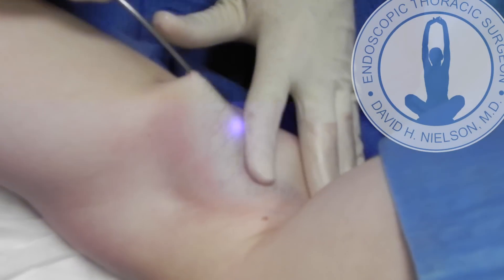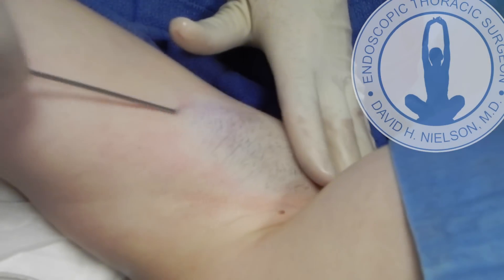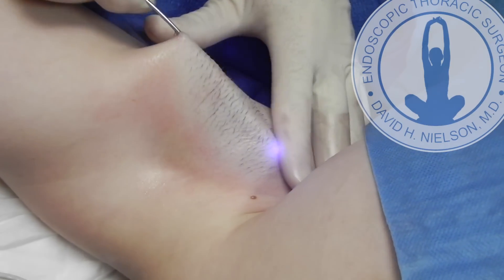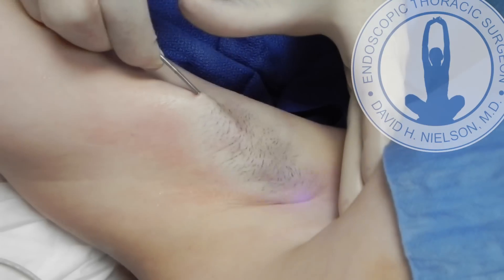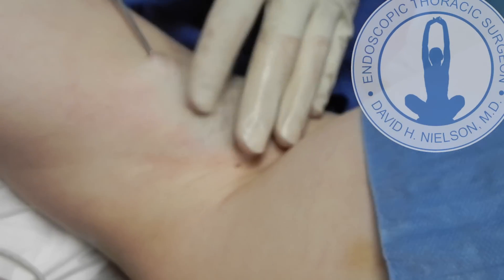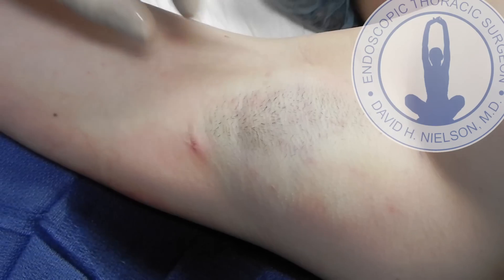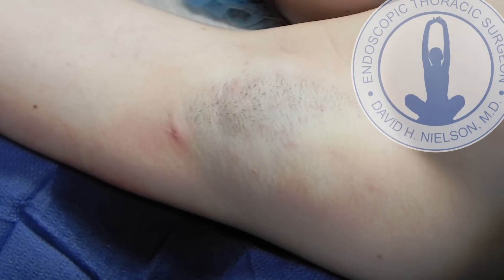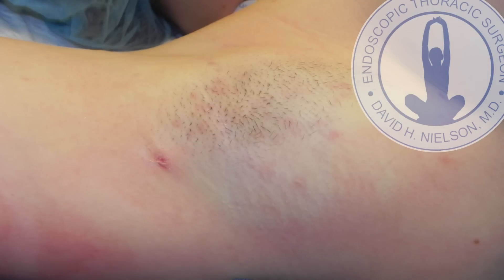As the patient is awake during this procedure, she was commenting to me today that it didn't even hurt at all. You can see there's no bruising, there's no blistering, and it's done through one tiny incision that's only 1.5 millimeters. Upon completion of the procedure, I close the small incision with a little bit of glue called Dermabond, and so healing is very fast.